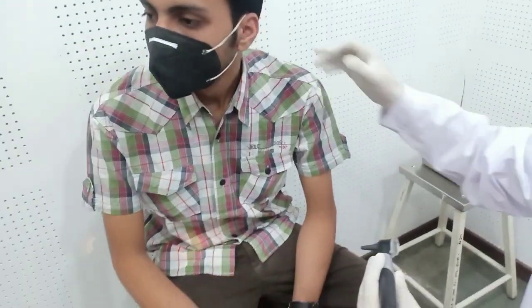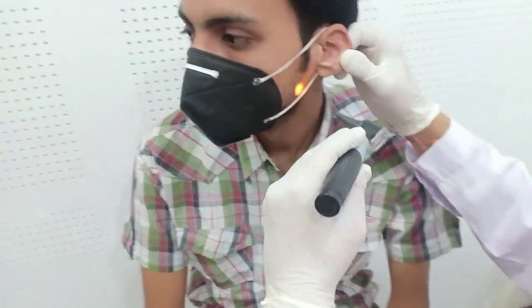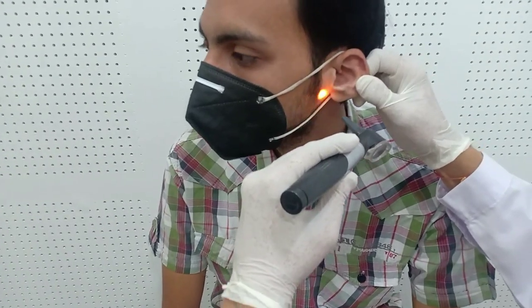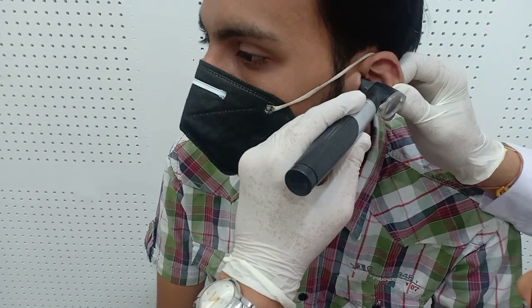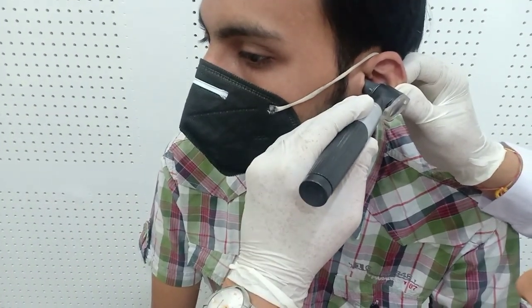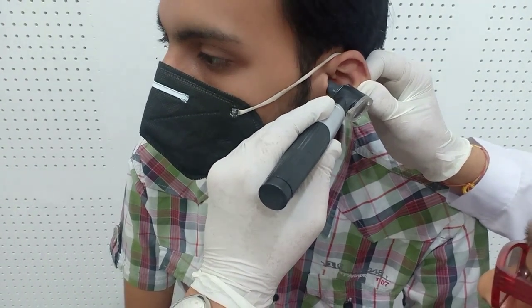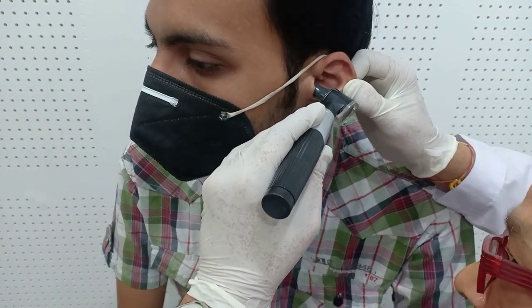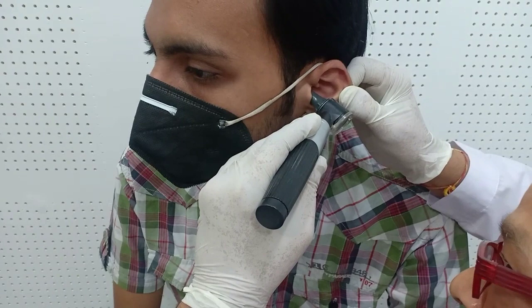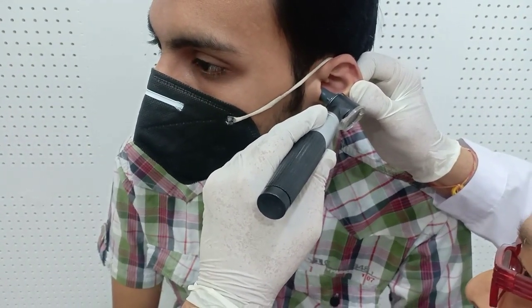Now, this is the left ear of the patient, and I will retract it with my right hand superiorly, posteriorly and laterally, and then we introduce the otoscope. I can nicely see the tympanic membrane. I can see the handle of the malleus, the cone of light, the grey colored semi-transparent membrane. I can see the lateral process of the malleus, Shrapnell's membrane, pars tensa, pars flaccida, umbo. So all these structures I can see very nicely.